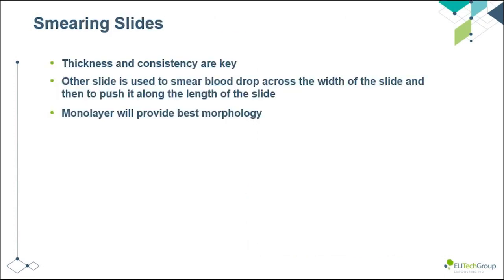In blood smears, a good quality slide begins with how the smear is made. It can't be too thick or too thin, and consistency is critical. Creating a good quality blood smear can sometimes feel like an art. It can take a lot of practice and trial and error, but once you get the hang of it, it will be a useful laboratory skill even if your lab uses an automated slide maker.